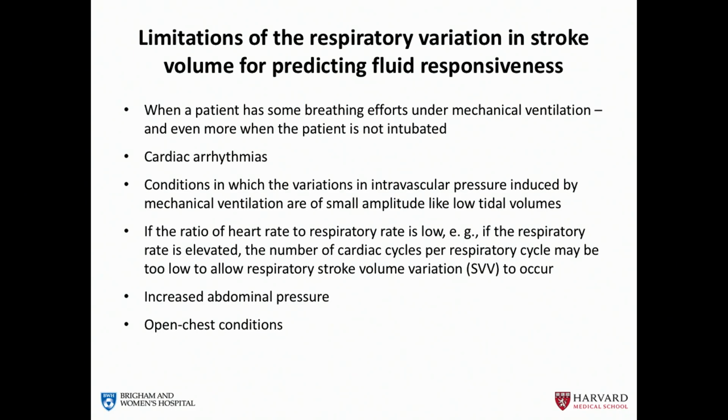Also in the setting of cardiac arrhythmias, such as rapid tachyarrhythmias like atrial fibrillation, atrial flutter, or multifocal atrial tachycardias, those can make these more difficult to interpret.